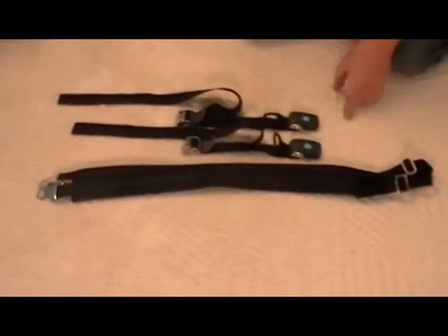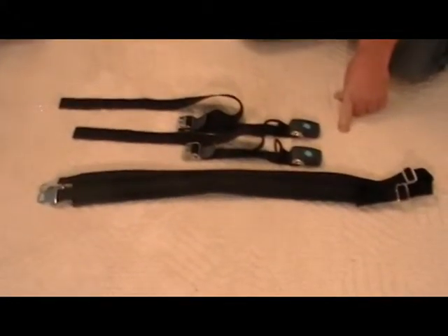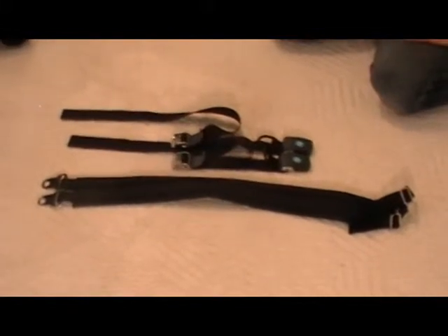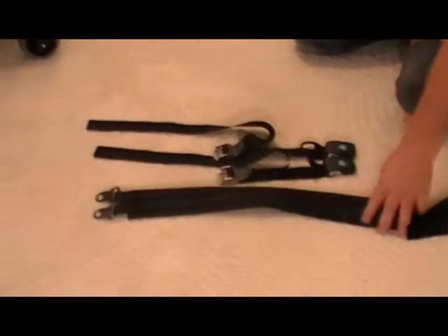Hi, I'm Rick Schull with Workbench Enterprise, here to introduce our second product, the Securiti. This is the Securiti, a positive chest restraint system. The Securiti consists of three different parts: two buckles and a belt.